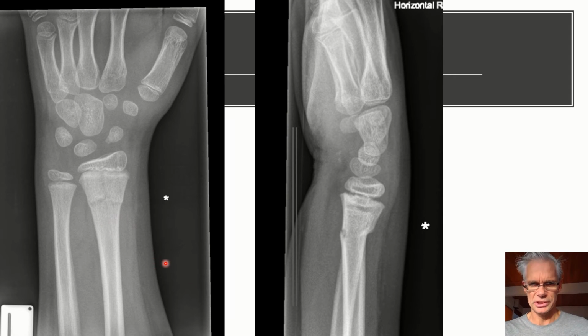These fractures in particular, you can see on the lateral where there's already a bit of angulation. These can easily continue to angulate even with splinting or casting. So you need to check them after a week. You can see a pretty nice position on the AP, and it's the lateral that we always have these dilemmas about. We're discussing endlessly how much angulation to accept. You get a little breach of cortex there. It's more vulnerable to carrying on to angulate further.